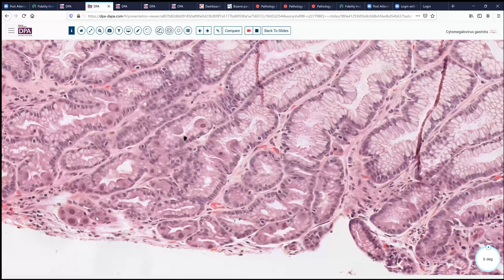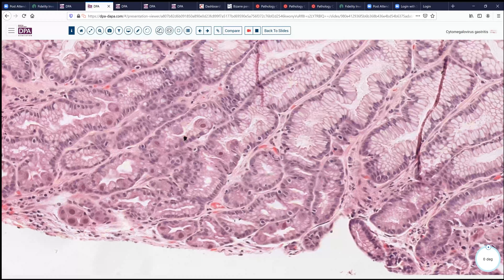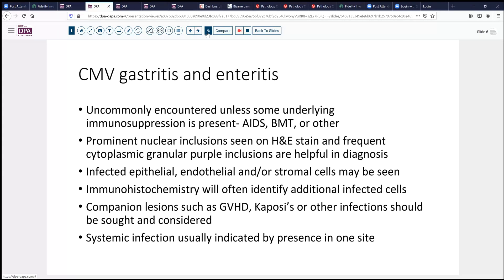Multiple epithelial cells are infected with what looks like cytomegalovirus. This is one characteristic pattern of CMV infection, and oftentimes when we find it in a pattern like this, it's not just localized infection — here's another one over here — it's a systemic infection. Usually we don't encounter CMV gastritis unless the patient has some underlying immunosuppression, either due to HIV/AIDS, bone marrow transplant, or other chemotherapy or immune-compromising disease.